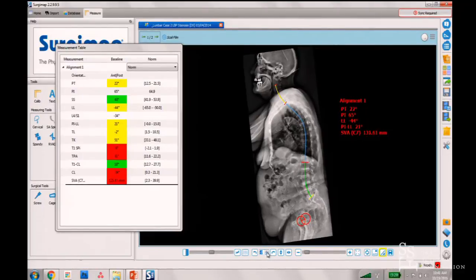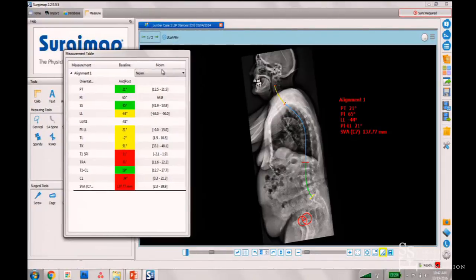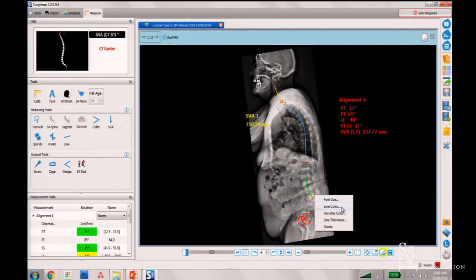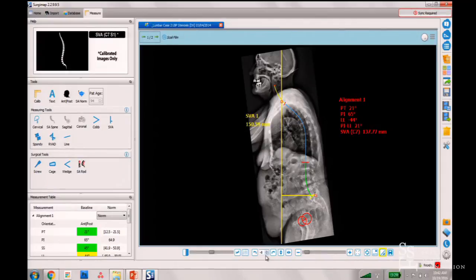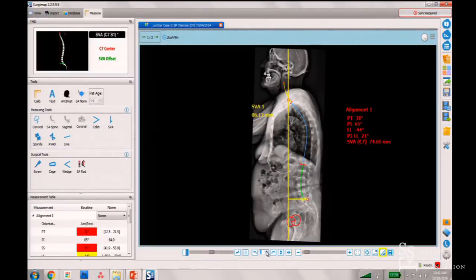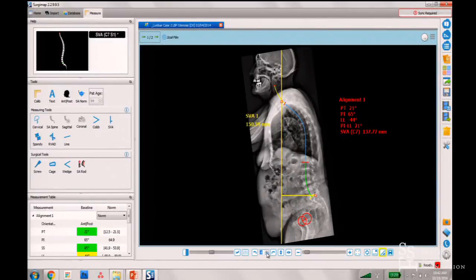On this specific patient the pelvic tilt is red — not good. If I remove the rotation of the pelvis, look at the global orientation and drop a plumb line for visual representation. By turning the pelvis backward, the patient brings the spine back to a vertical position. It's important to understand the natural orientation for this specific patient — they compensate at the level of the pelvis.